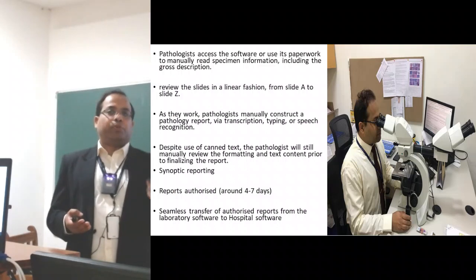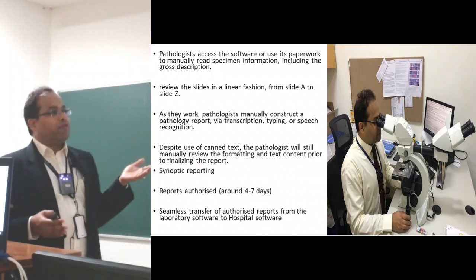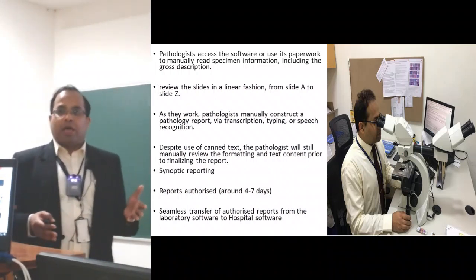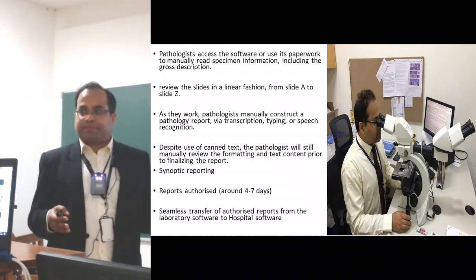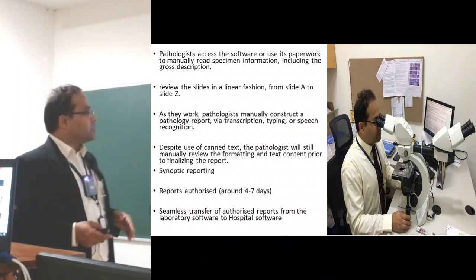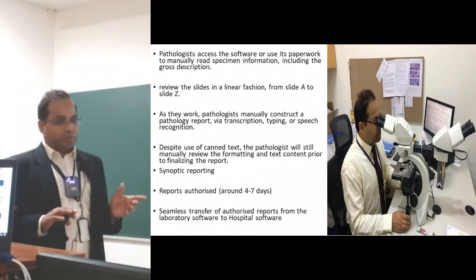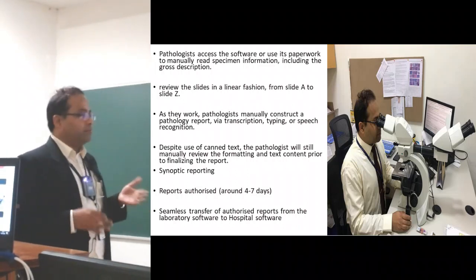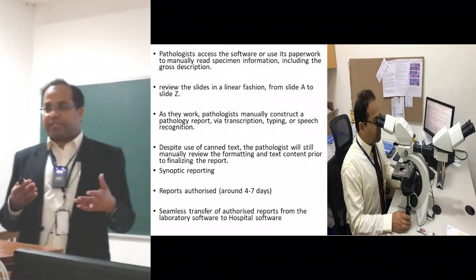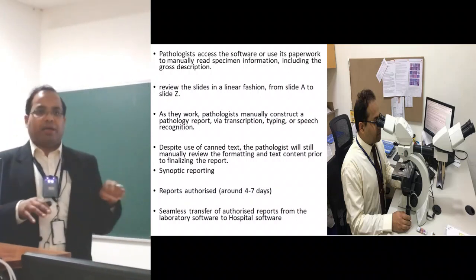They may want some particular tests, or to know the history. For a big case like a part of the colon that is removed or a head and neck specimen, we might have 30 or 40 slides. I have to see each and every slide and start manually constructing the report, which can be done by typing, transcription, handwriting, or speech recognition. I do a mixture of typing and dictation software, where I tell the computer and the computer starts typing the report.